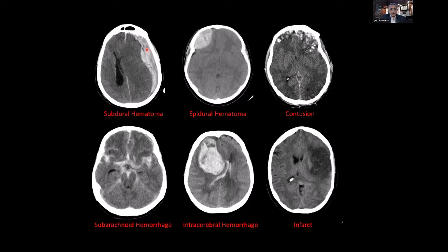Blood, typically in acute and subacute blood, will show as hyperdense. So this is a subdural hematoma. The epidural hematoma looks like a lens, and then in contusion you have intraparenchymal blood, which is showing as hyperdense signals in here. It depends how you dial the contrast and all that. In some pictures, you lose the gray-white junctions. And here you can see it better, even better than this one, and you can start to figure out some of these structures over here.